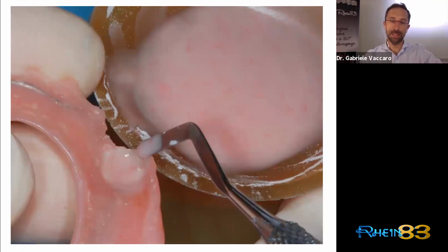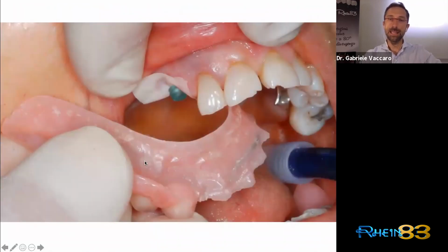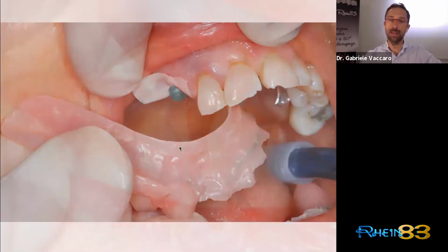The lab gives us the denture with the empty body. We fill it with liquid resin, and then put it right over what we have prepared before. So we have here the root with proper root canal therapy. We place a protection to prevent the resin from going below the sphere, then the rubber dam, then the female cap, and then we put the prosthesis.